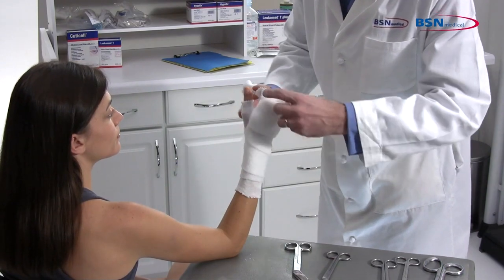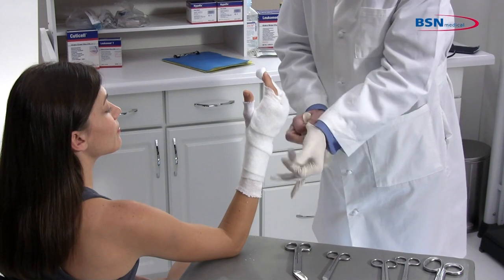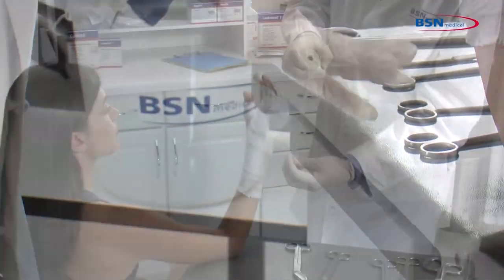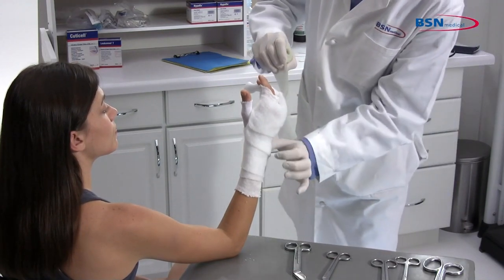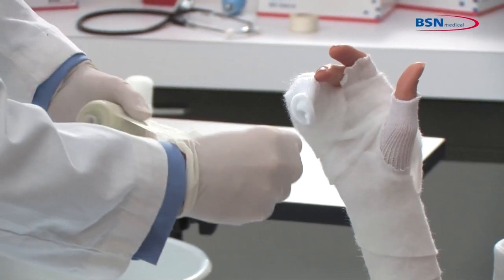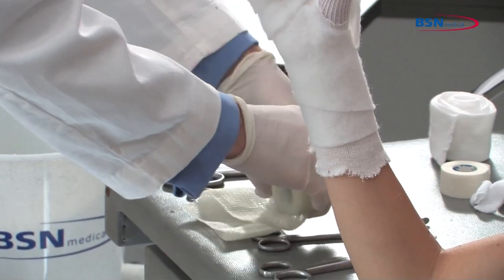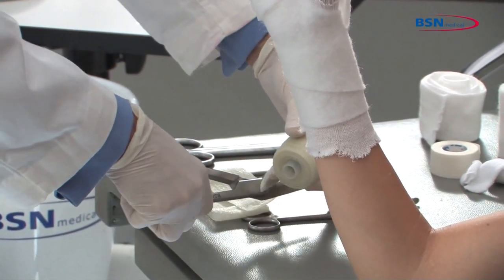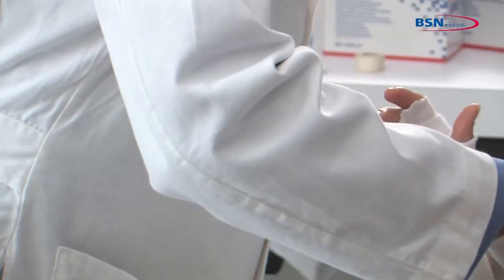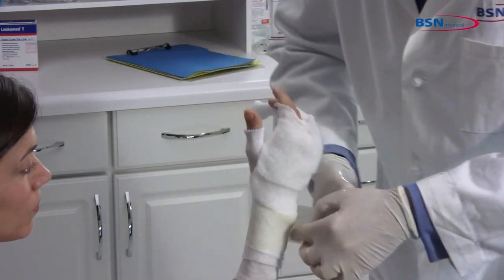Make sure the patient's limb position is correct before starting to apply the cast tape. Begin by putting on protective gloves before applying the cast tape. Measure using the cast tape from distal phalange to wrist. Fold over two times to make three layers, cut, and reserve to the side to be used as a reinforcement strip. Dip two-inch or three-inch cast tape in water, squeezing one to three times. Remove from water and squeeze one time to remove excess water.